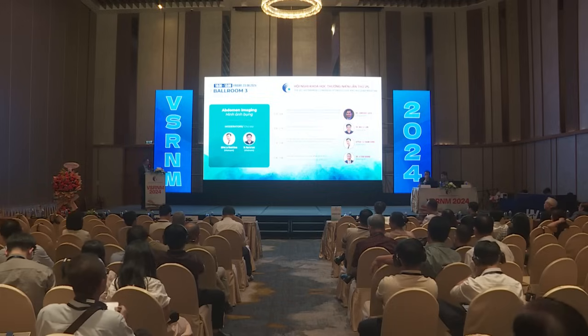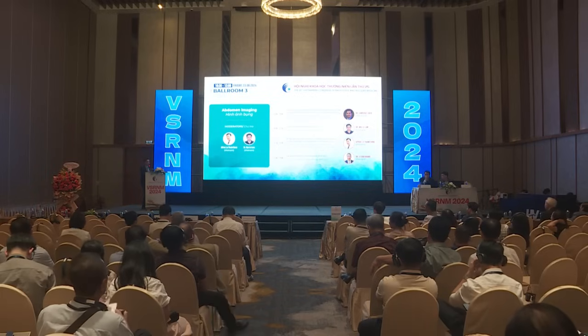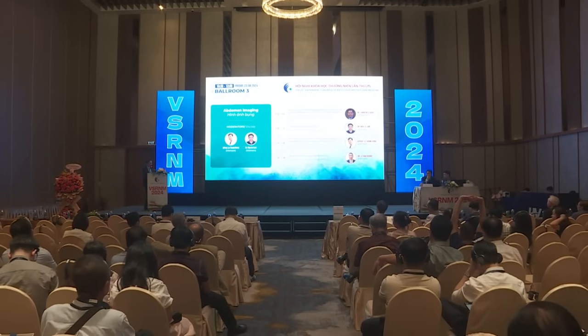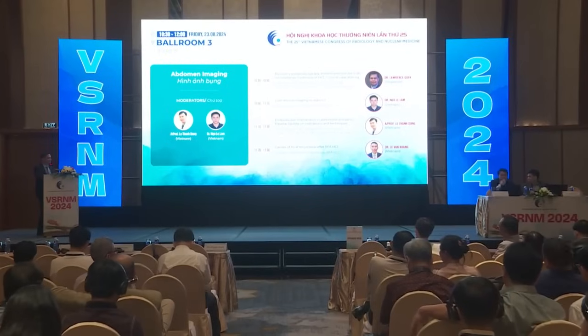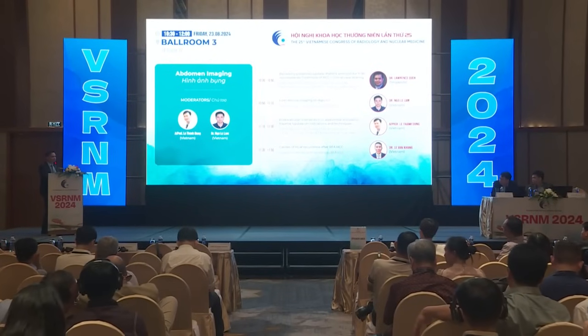Actually, we used both compounds. We started our practice using SIR-Spheres, and we were proctored, and then after that we moved on and used TheraSphere because Boston Scientific bought over the company, and then came over to Asia and decided to set up. So there are benefits to both, so to speak, because the SIR-Sphere plant is in Singapore, so you can get access immediately, whereas for TheraSphere, we have to wait about 10 days for the dose to come in.